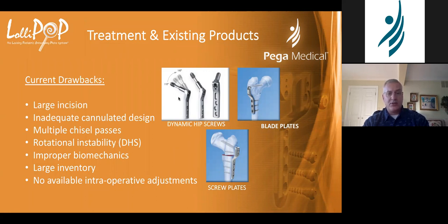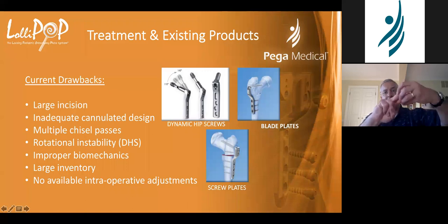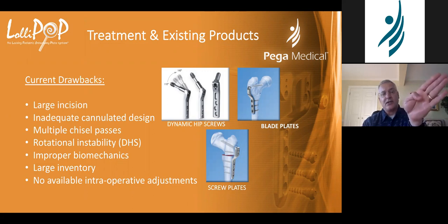Rotational instability: if you have a DHS, the fragment can roll around the screw of the head. That screw is in, but the head can turn on that screw, and you don't have any rotational stability. The keyed element tries to fix the screw inside the blade plate, but the bone itself can still rotate on the screw.